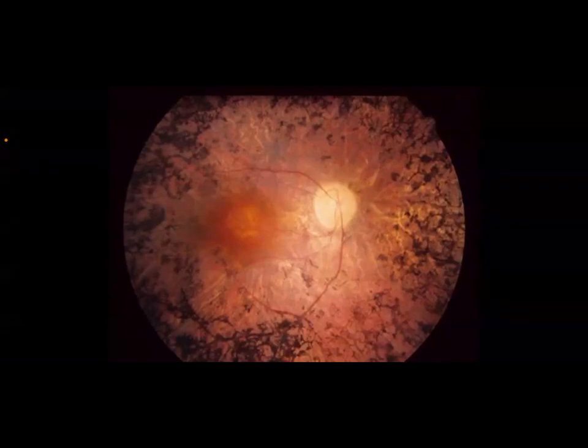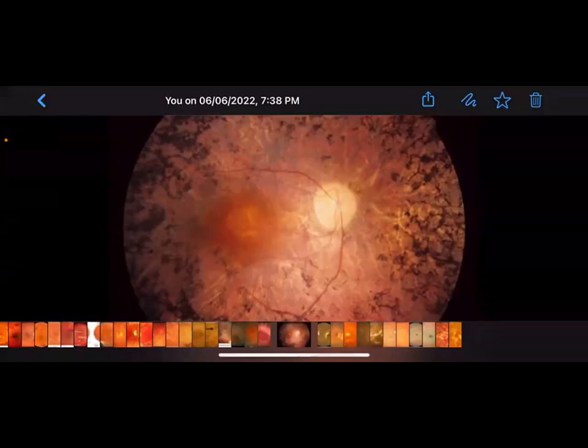As soon as he looks into the light source, he will bring the macula into focus. Okay, even if you do not see the hyperpigmentation of the macula, just ask the patient to look directly into the light source. He will bring the retina, the macula, into focus. Okay, see if there is any glary things going on here.